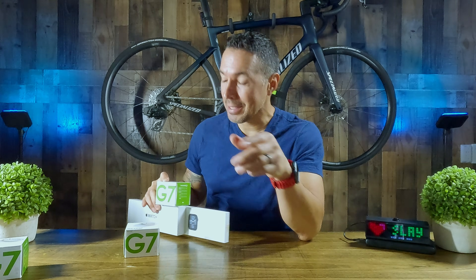Dexcom Share — this is a big question a lot of my viewers have. Is the Direct to Watch connection going to work for Dexcom Share? Yes, but not yet. Dexcom Share allows you to send your CGM readings via the Share app to another person who has the Dexcom Follow app so they can view your numbers. According to the Dexcom G7 Direct to Watch landing page, there are plans to include this feature in the future. Also, don't forget that the sensor session ends every 10 days, so remember to pair your Direct to Watch after setting up each new sensor. After setup, you should receive a prompt on your watch to do so. If you have the Dexcom G7 and Apple Watch and are using Direct to Watch, I'd love to know what you're using it for.